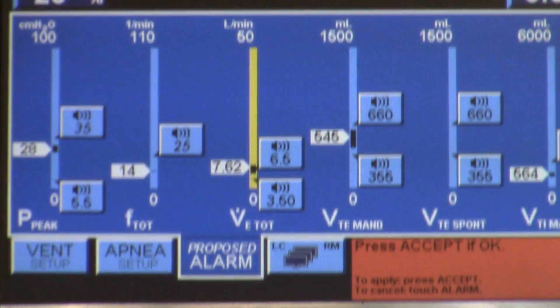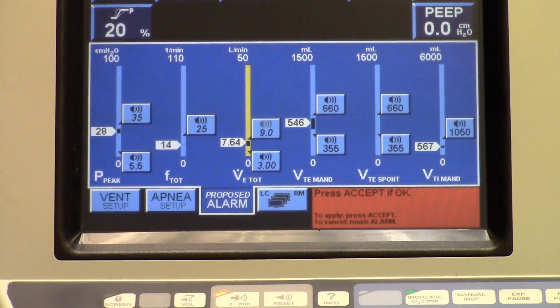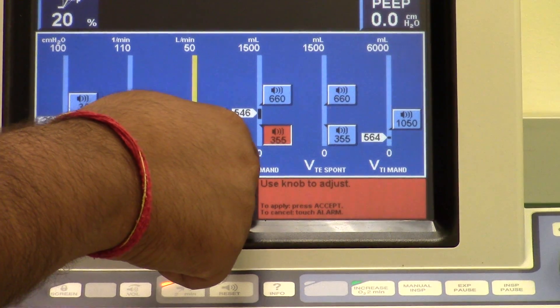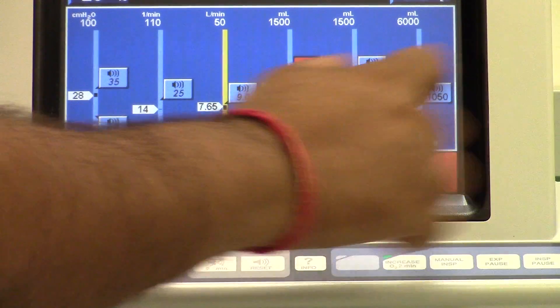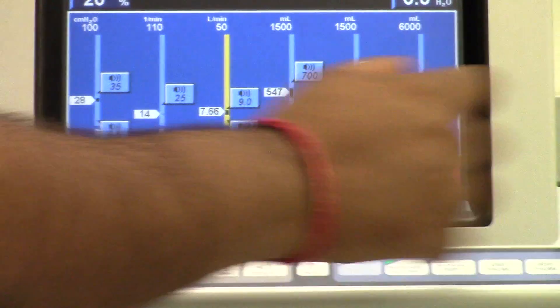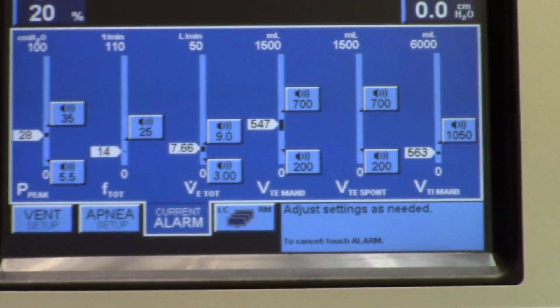For our low and high minute volume, we're going to set our low to 3 liters and our high to 9 liters. For high and low tidal volume — both mandatory and spontaneous — we're going to set the low to 200 and the high to 700. The high follows together so we just need to set the low to 200. Then we hit accept — so we accepted those changes.